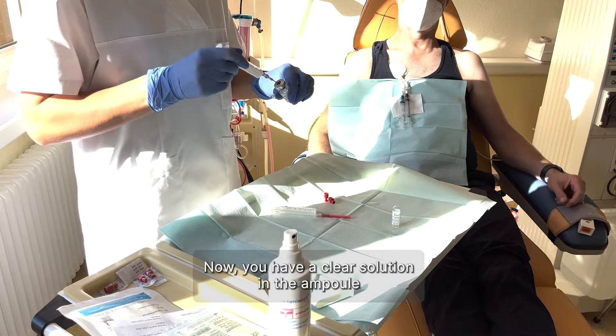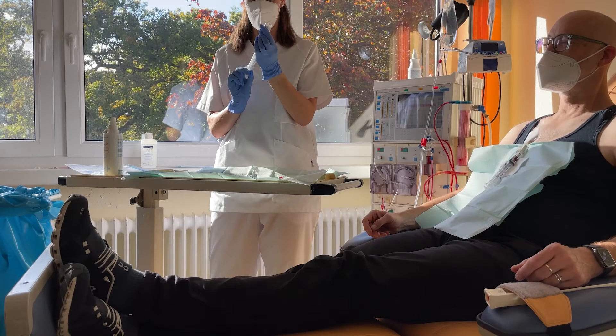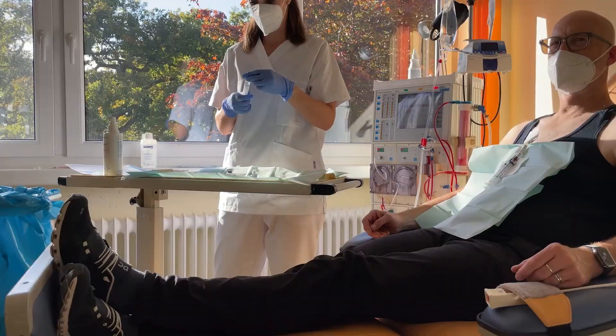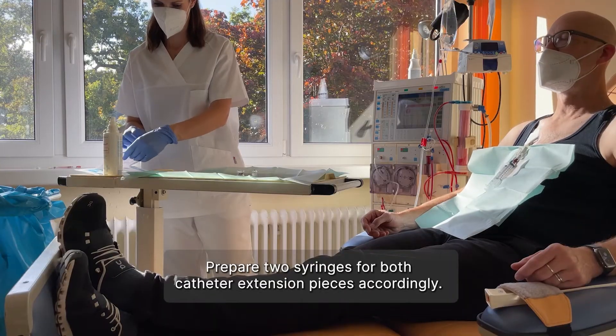Now you have a clear solution in the ampule that you can withdraw with an appropriate syringe. For optimum results, apply the solution right away. Prepare two syringes for both catheter extension pieces accordingly.